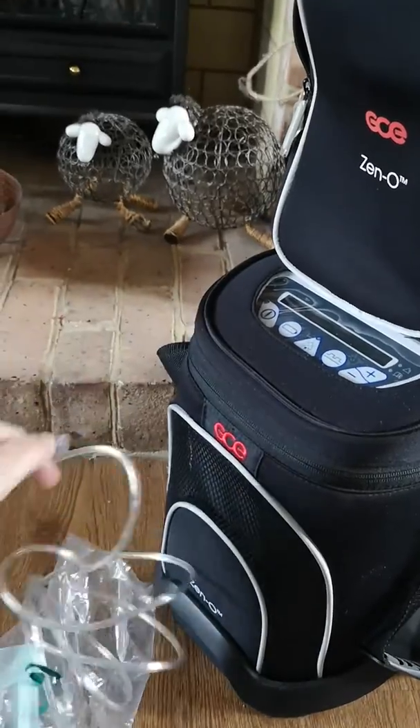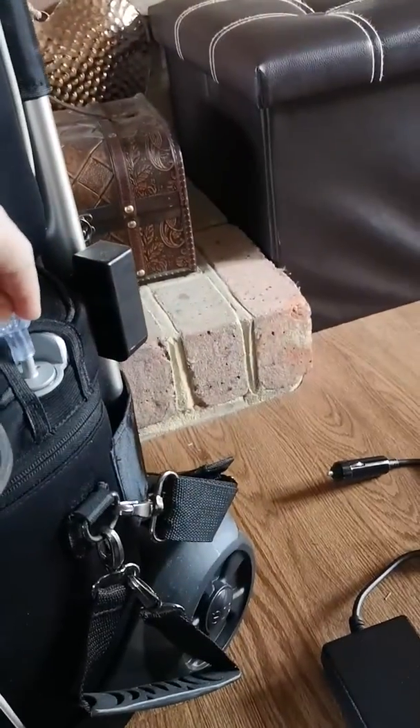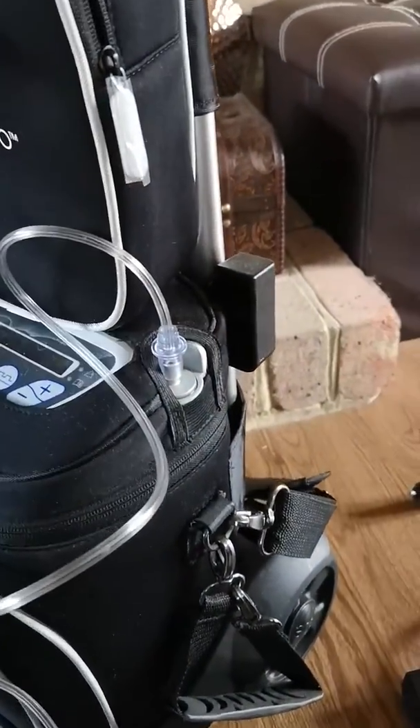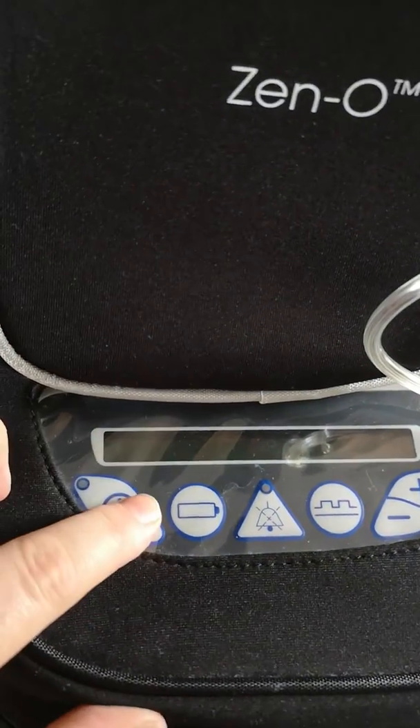That's the mask that came with it and the tube which goes on here — push that on there. And then you push on.